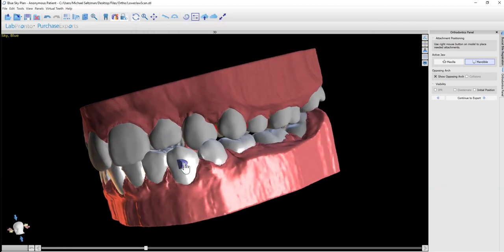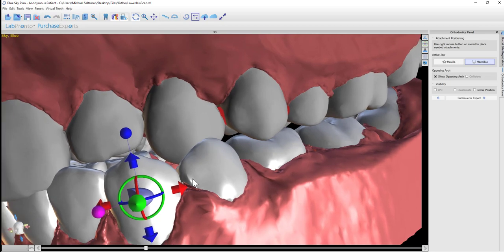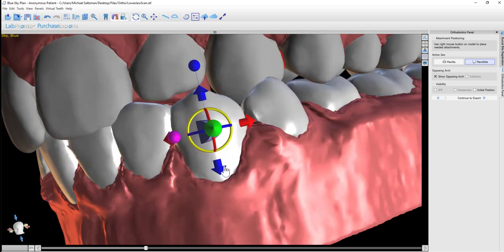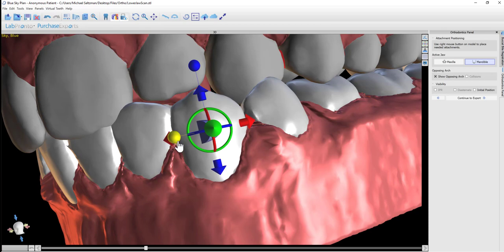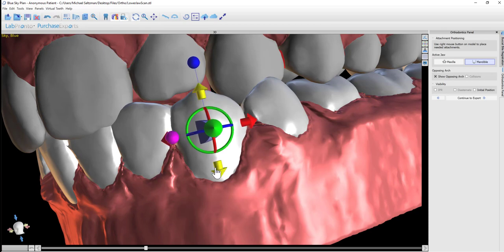The software has added the button to the tooth. You're able to manipulate the button attachment, rotate it, resize it, and use the different controls in the widget.